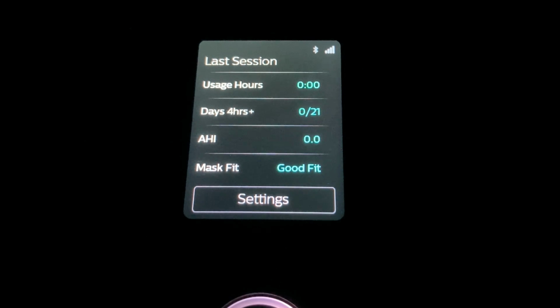Whenever you're trying to troubleshoot leak, it's important to think about all the possible places where you can get leak. You can get leak from the mask. More often you will hear the sound of the leak, although sometimes it may not wake you up if it's just at the right angle where it's not making very much noise. But if you're getting a lot of leak and it's not waking you up, also consider the possibility that your mouth may be opening. It's common for people, particularly when they're new on PAP, to first sleep with their mouth open when they're in deep sleep as they're adjusting to PAP. And so sometimes we need to do things to help you be better about keeping your mouth closed.